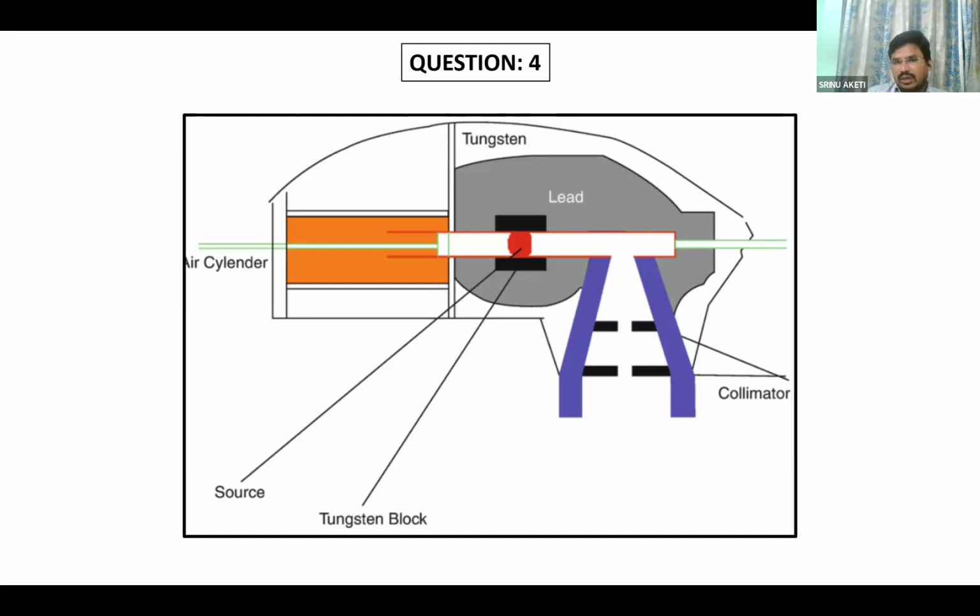Okay, no issues. Any idea about safety issues, or any advantage over LINAC? What is the source size? Sir, it is around 2 by 2 centimeters, and it will mostly be a cylindrical source in the form of pellets inside the head, sir. It will have emergency alarms and also safety measures.